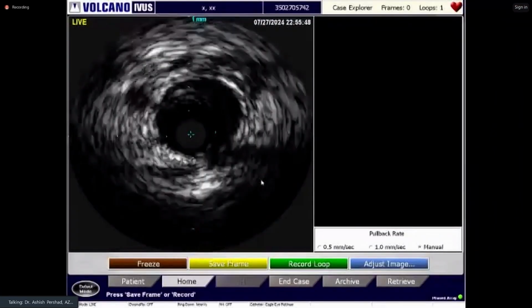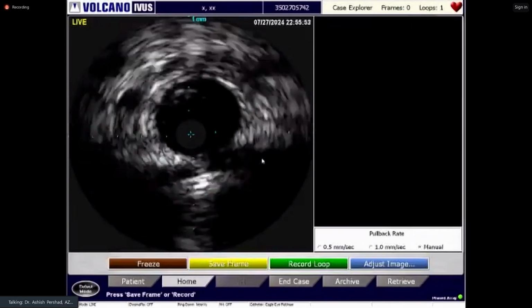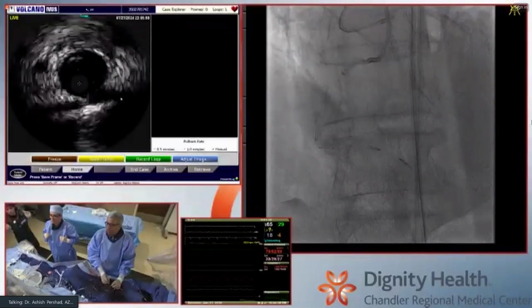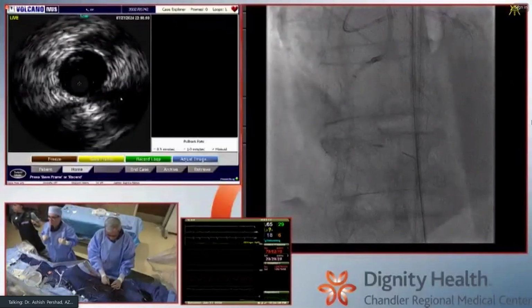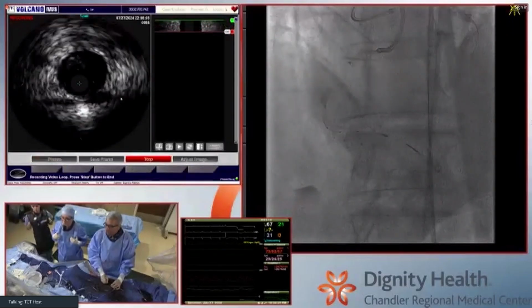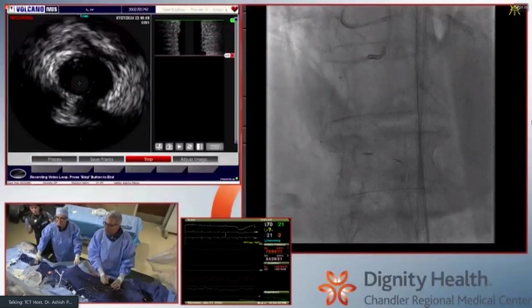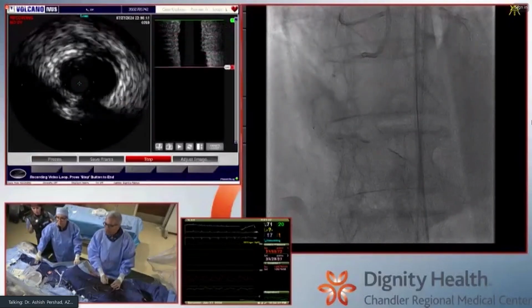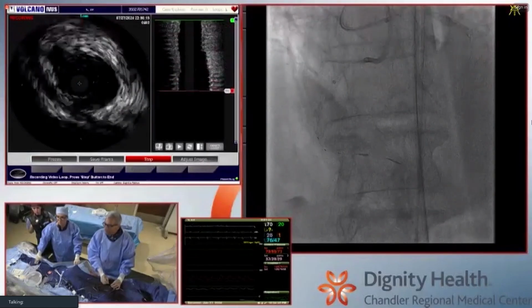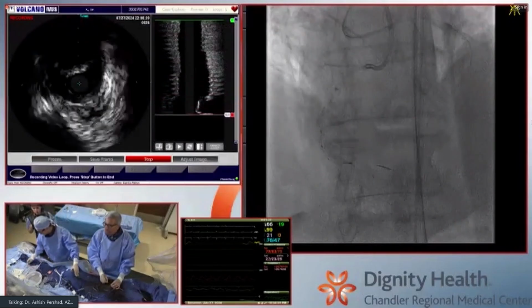All right, so Akiko, we're back. Here we are in the distal lumen. So you think a 3.0 is the appropriate vessel size distally? I think so, yeah, for sure. All right, so this is the true lumen here, and then we keep going back. You're in the PDA there. Exactly. And you can see the beginning of little branches coming in on the false lumen side. And there's the false lumen starting right here. Okay, and then keep going. This is all that calcific subintimal false lumen in the knuckle segment.